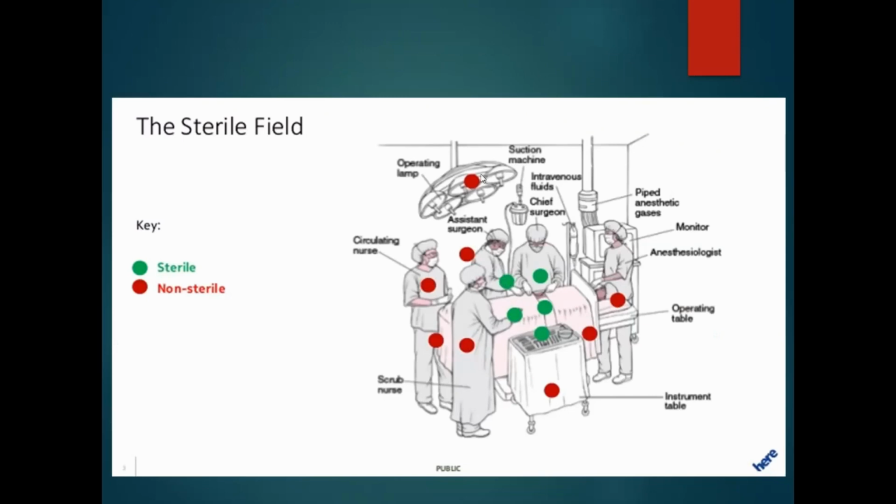The OR lights that you'll see up here, we have sterile OR light covers that we use to place on these handles that you can see sticking out right here. So you have to be really careful when you're placing those light handle covers, and make sure that your hand or fingers don't accidentally touch the outside as well. That's where I tend to see a lot of students contaminate, because they don't pay attention and they try to put it up real quick. So they're super nervous, whatever the reason, and they contaminate their gloves on here.